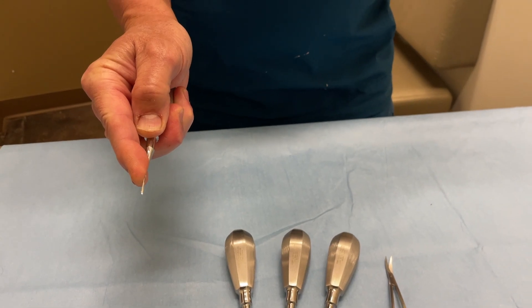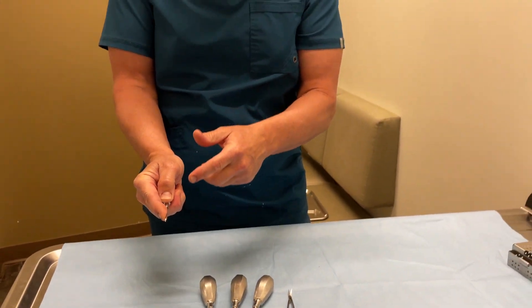Why is that important? Two things. Number one, it avoids you slipping and going into bad places if you slip off the bone. And number two, luxating elevators are designed to be used in a push-in motion as opposed to a twisting motion. So you have to have it well seated in your palm so you get that force going in there.